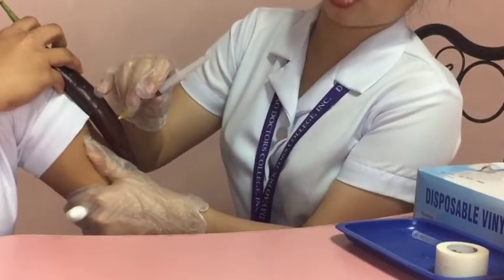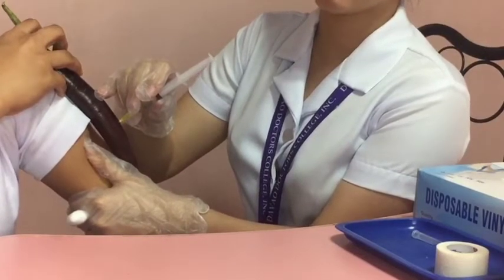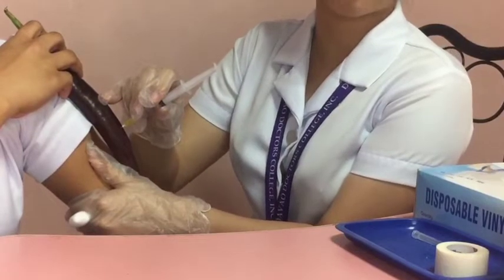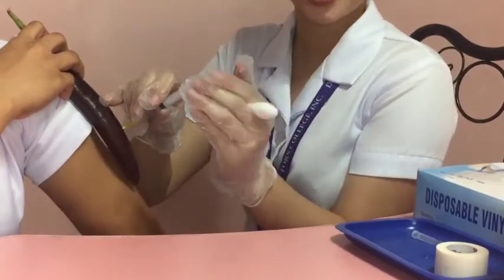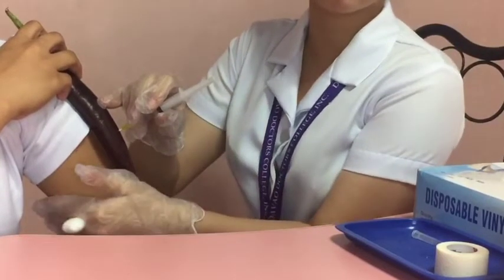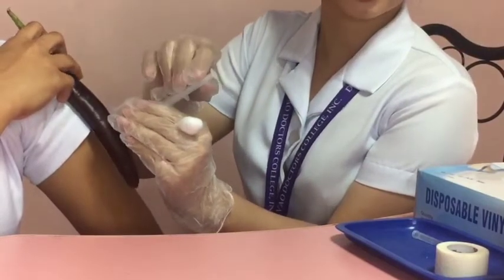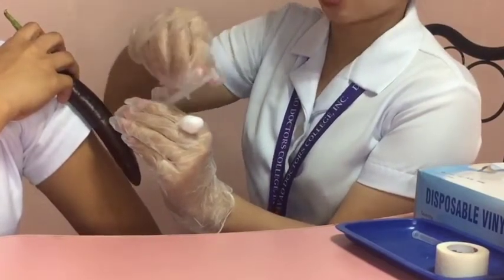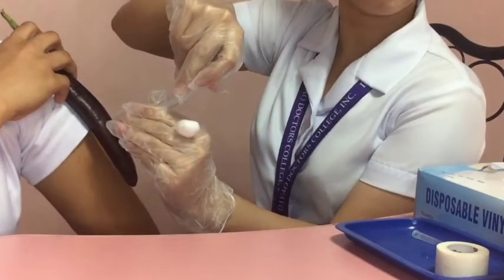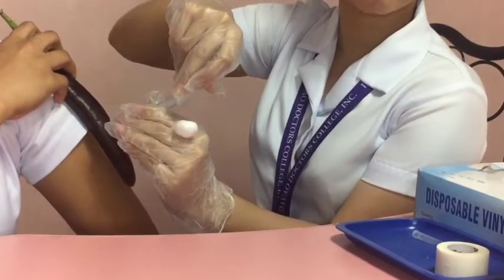So now, after inserting the needle, hold the barrel of the syringe steady with our non-dominant hand and aspirate by pulling back the plunger with our dominant hand. Aspirate for about 5 to 10 seconds. If the needle is in a small blood vessel, it takes time for blood to appear.